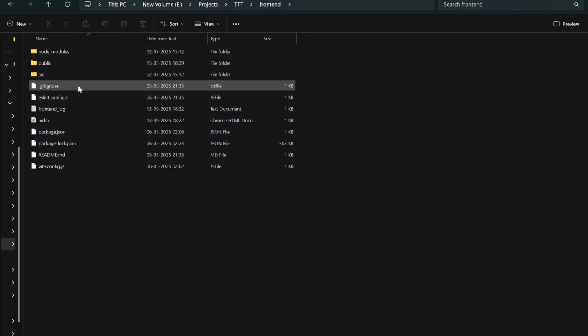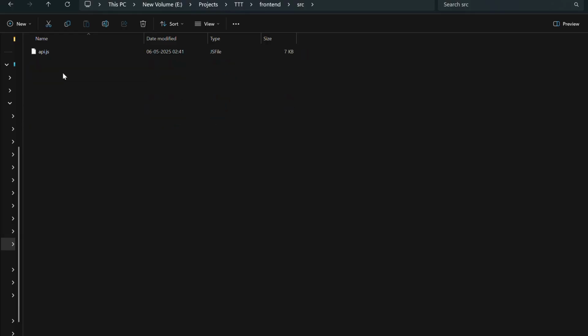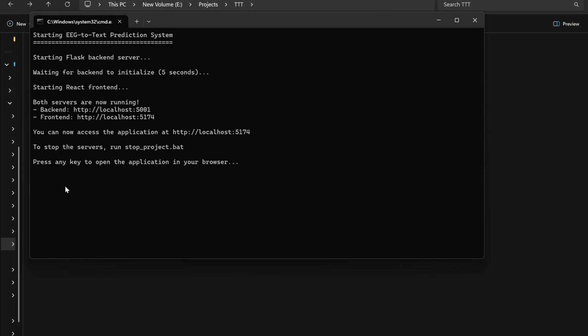Now let's move on to the source files in this SRC data. We have one file called api.js, which was a JavaScript file that we basically had to create different checkpoints or endpoints to our API. Running this API, the backend and frontend get run on different local hosts. Now let's first try to access our frontend.